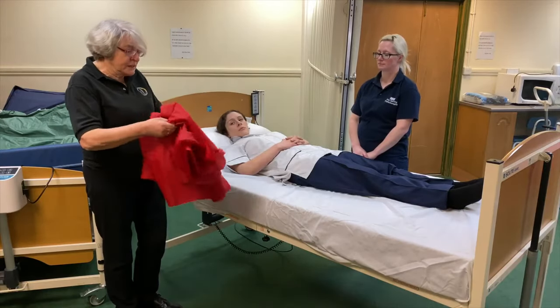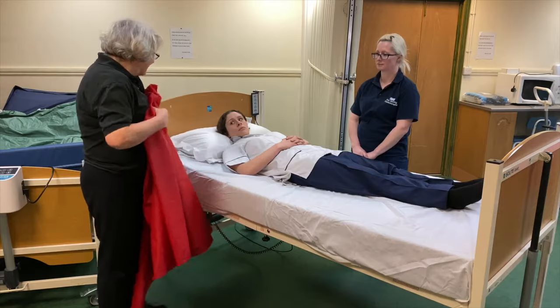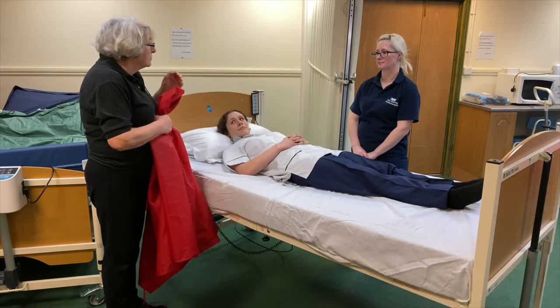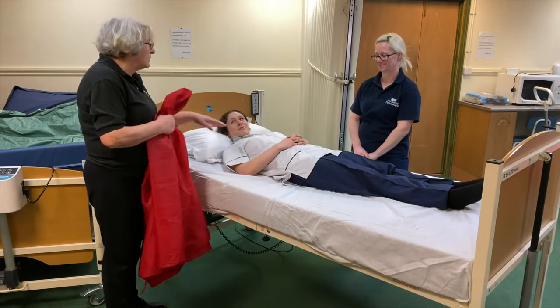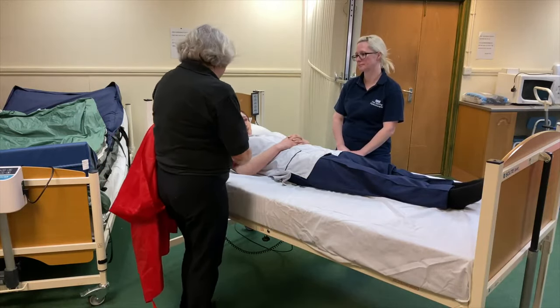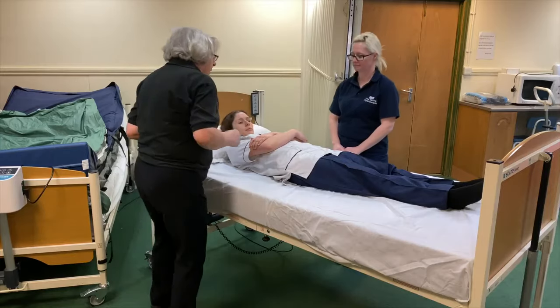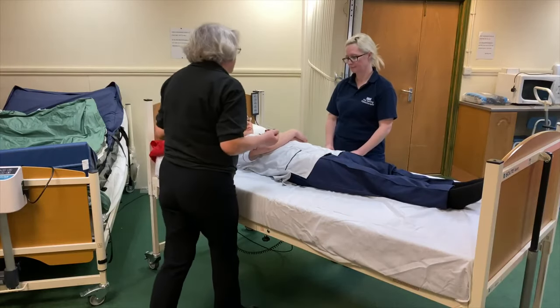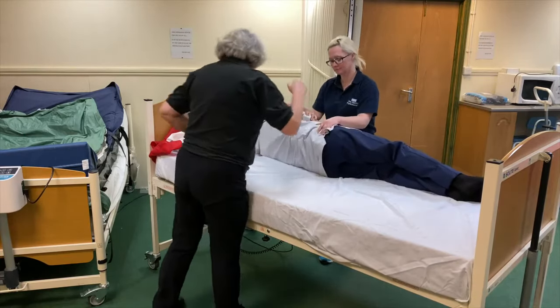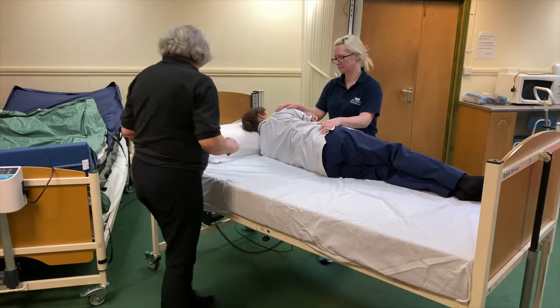So here we have the slide sheet, and here we have Lisa. Okay, so we're going to roll again, and I'm going to roll. We have Alice on the bed, and I'm going to roll her to Lisa. Okay, this time we're not going to move your legs, just to prove they don't have to be. If you can give yourselves a little cuddle. Okay, thank you. Just while I'm rolling you, I'm going to give the command again. Ready and roll. Okay, Lisa, you ready? Are you ready? And roll. Okay. Hand on shoulder, hand on hip, so your legs are in movement. So you're doing a nice bobbing movement.